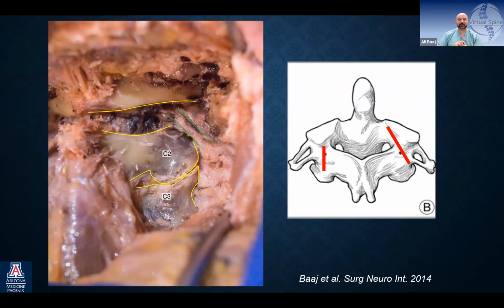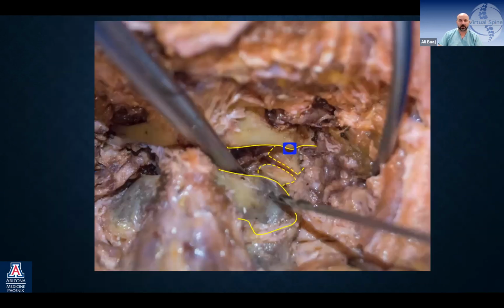Parsicle, yeah. You can call it whatever you want, but I'll tell you what you can't do. And I see this a lot, unfortunately. You can't say, well, I'm just going to put a pedicle screw if you don't confirm that the patient has a decent sized pedicle. And vice versa. You can't just say, well, I'm just going to put a pars screw without knowing whether a patient can tolerate it or not. Where people get in trouble is they put a pedicle screw in a patient with a high riding vert or no pedicle. That's where you get in trouble. So you can put a pars, you can put a pedicle screw, but you have to know the difference and when you can use either.